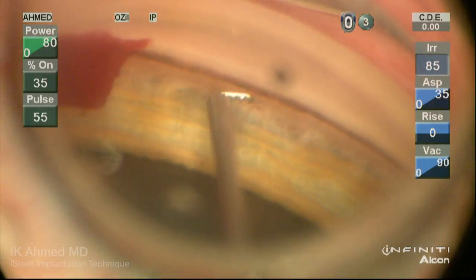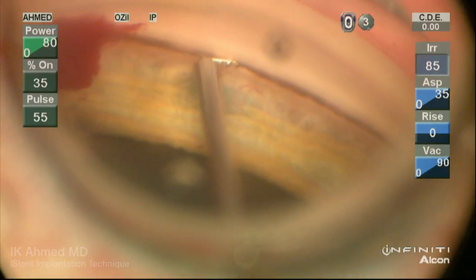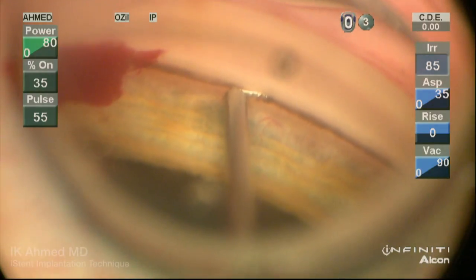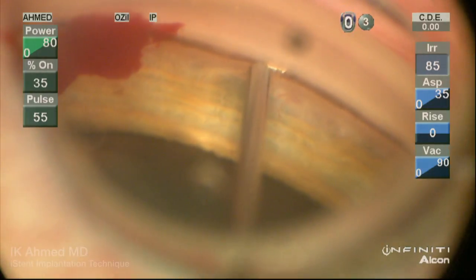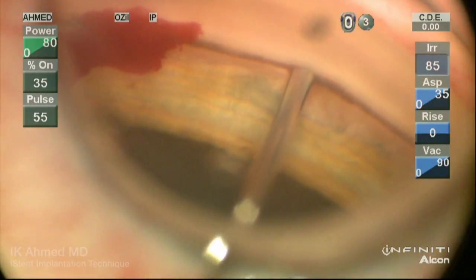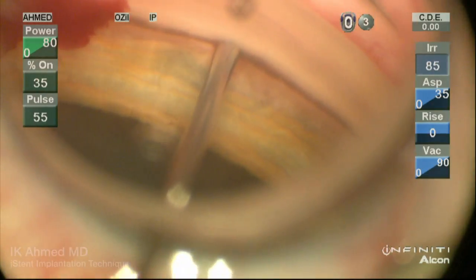Our second iStent is being placed, this time in a backhanded fashion, again approaching the angle at a 30-degree angle approach. The self-trephinating tip incises the inner wall, and the main body of the device is slid into the canal by straightening the hand out and pulling toward us slightly to ensure smooth passage.